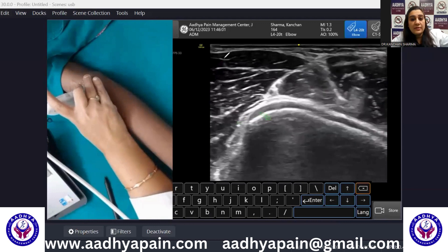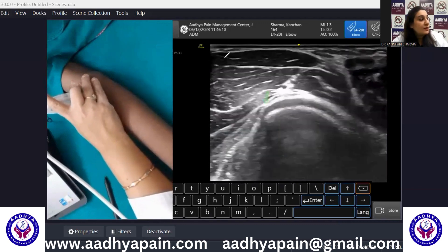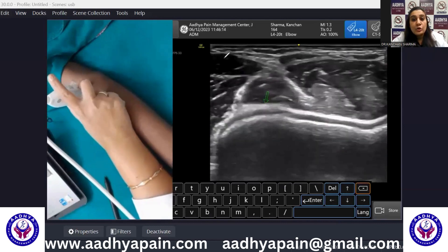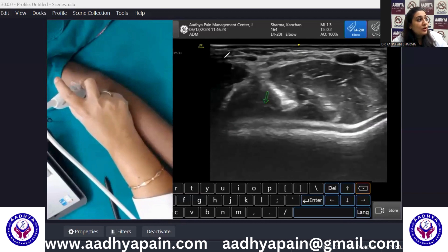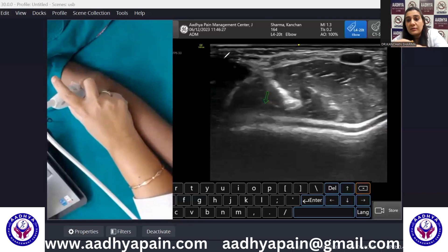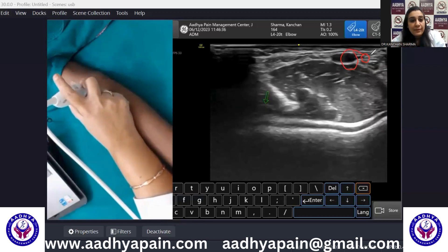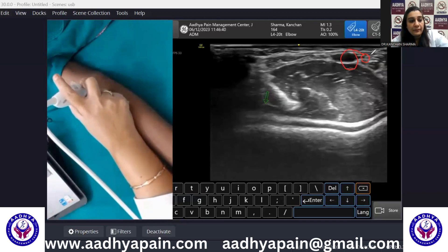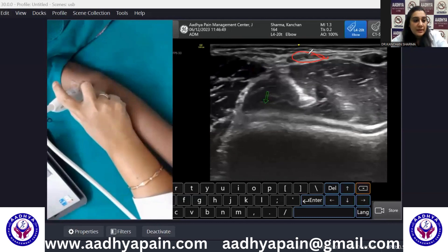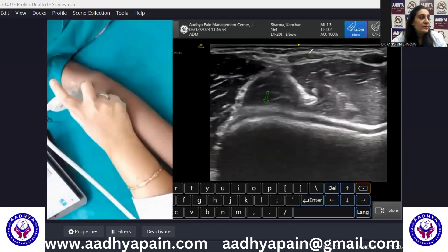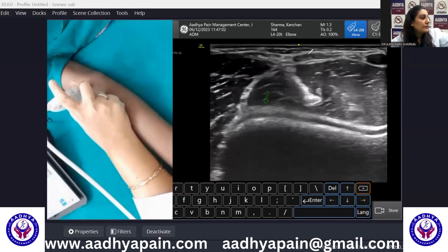On the live scan, the capitulum is identified. Sliding the probe medially, the brachialis muscle is visible. A pulsating structure is seen — compressing it confirms it collapses: that is the brachial vein. The adjacent non-compressible pulsating vessel is the brachial artery. On top, the distal biceps tendon is clearly visible. The distal biceps tendon has a short head and a long head, which will be discussed in subsequent presentations.